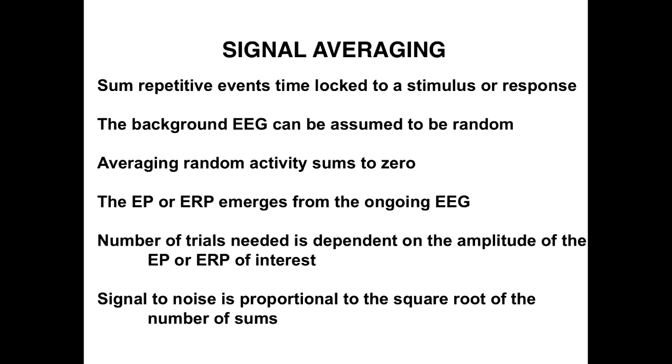The number of trials that you need to get a reliable response is really dependent on how big of the brain response you're looking at. For the brainstem evoked response, which you all had when you were babies, the response is only about half a microvolt. So you need to do a lot of trials to get a clean response, but you can do it quite quickly in a couple of minutes.